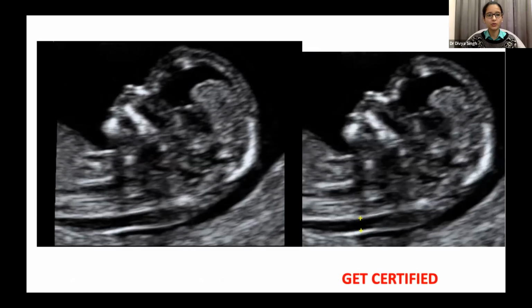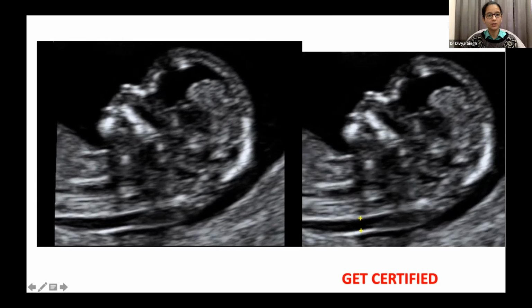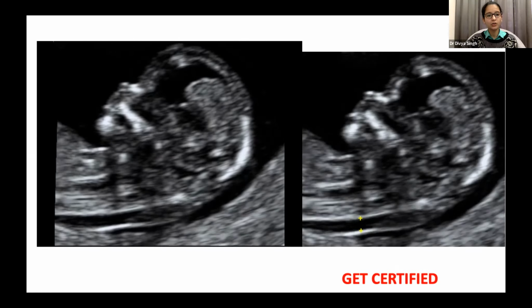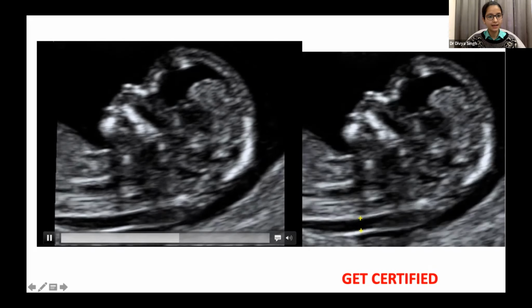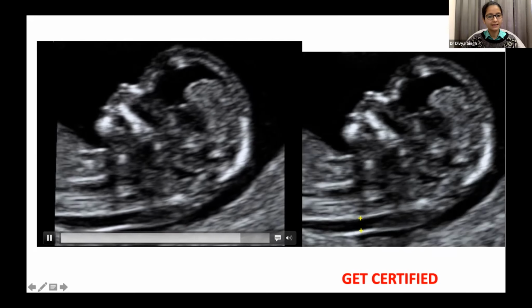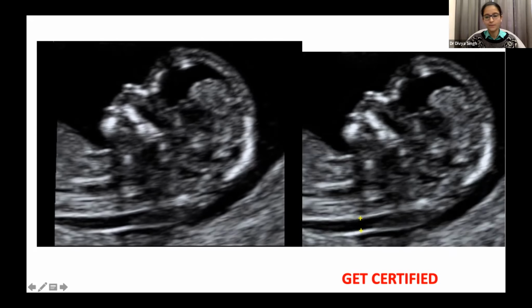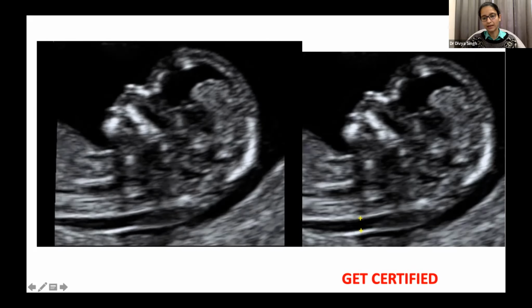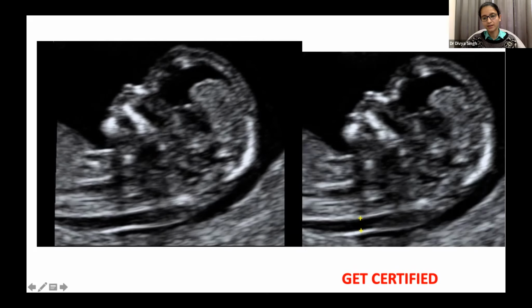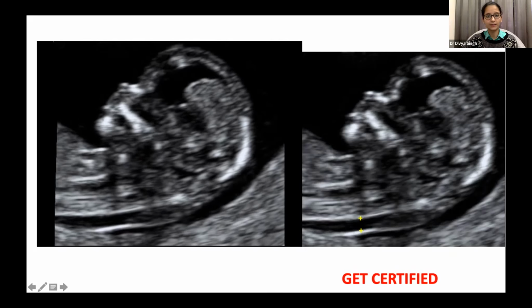Now, just to show you a clip with the fetus in the ideal mid-sagittal position with optimal magnification, neutral position, you can clearly see the landmarks: the echogenic tip of the nose, the diencephalon, the palate, and the nuchal membrane. And this is a still image obtained from the same clip showing you the placement of the calipers such that the crossbars lie on the inner border of the white line and not in the nuchal fluid.